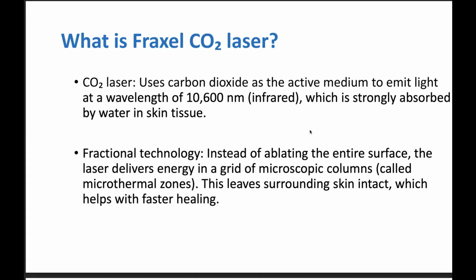And the next is the fractional technology. Fractional technology is a kind of laser module that we use to treat a small region in a very small column to treat the skin region instead of ablating the entire surface. So it leaves surrounding skin intact, which helps the healing become faster and more safe. So the next slide.